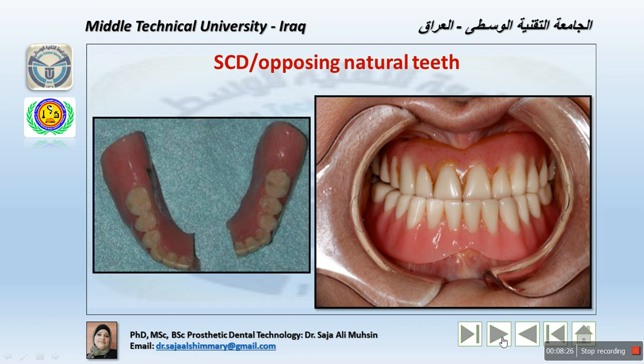The difficulty is found with the maxillary mandibular jaw relation for the single maxillary denture. The finalized maxillary wax occlusal rim may not be parallel to the ala-tragus line, since the opposing occlusal surfaces of the mandibular natural teeth will dictate the angulation of the occlusal plane.